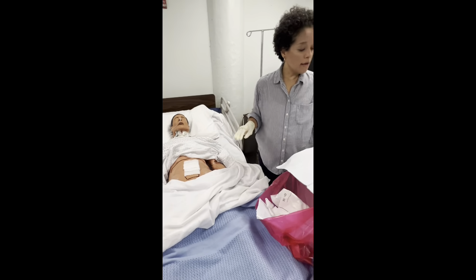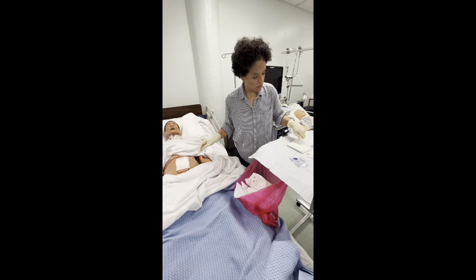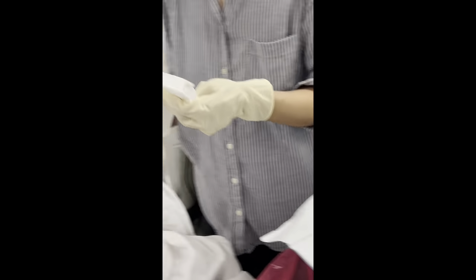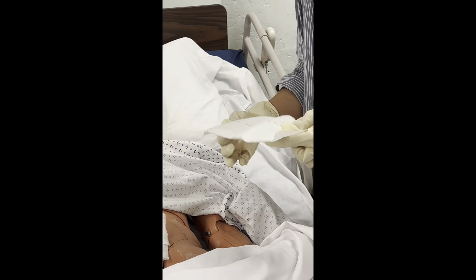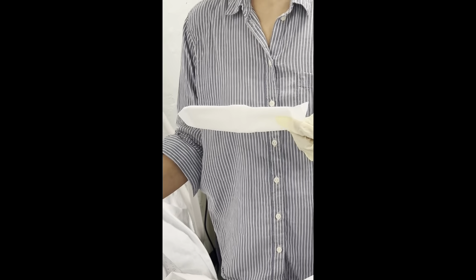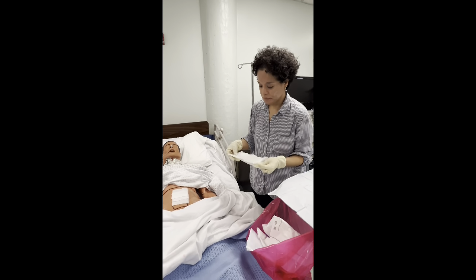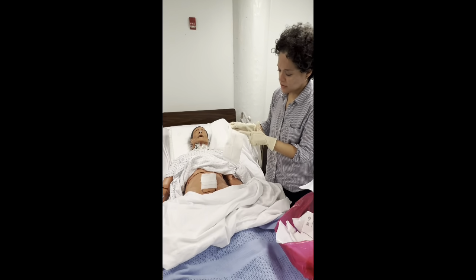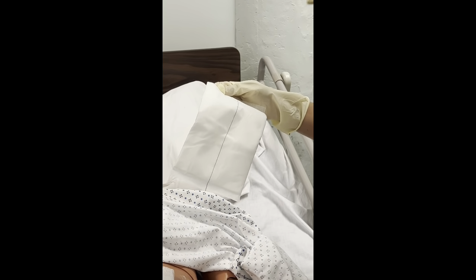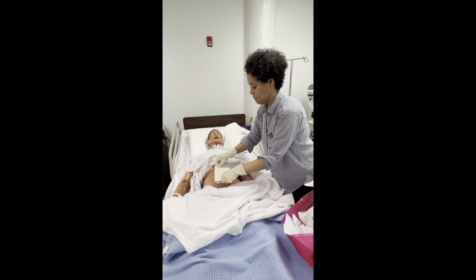We are going to now apply the dressing pad. And at this point, both hands can actually work, right? Since we have the site covered, yes, you may use both hands at this time. So it's a good indication. We have a blue line here. So the blue will be facing upward. So blue to the sky. Cover the area.